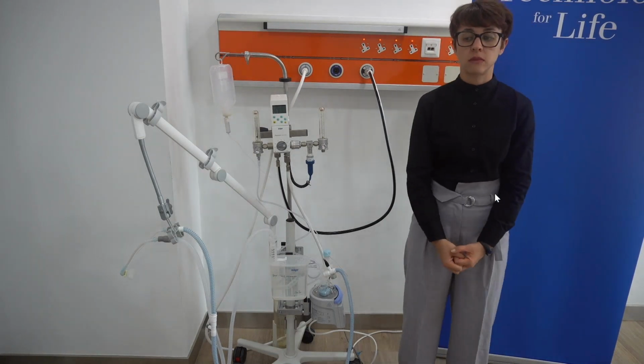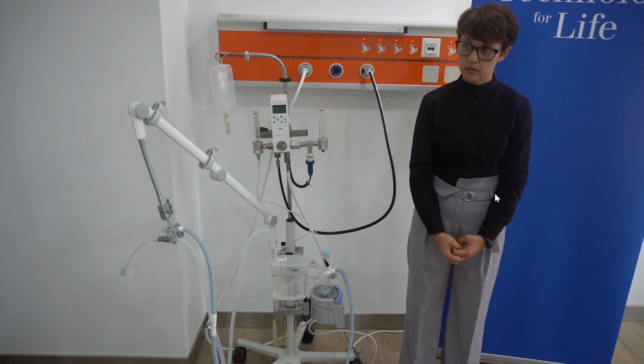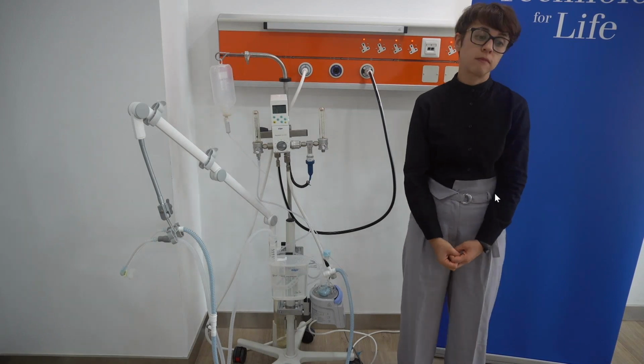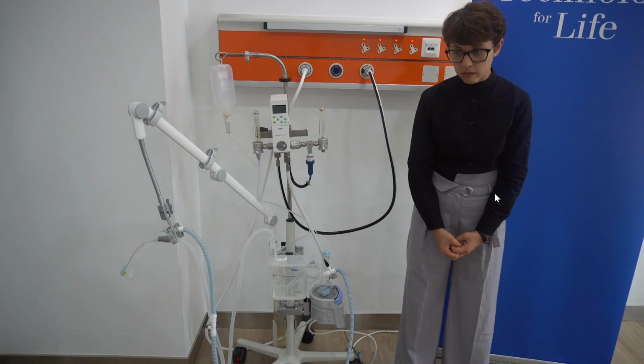Generally, the flow that will be required usually runs between, sure, I'm not sure on that system, but generally it runs between 5 and 8.